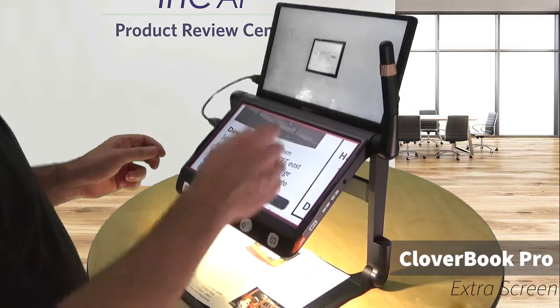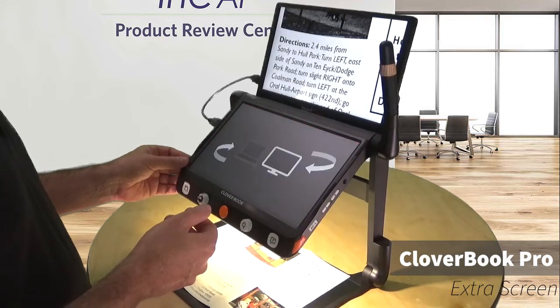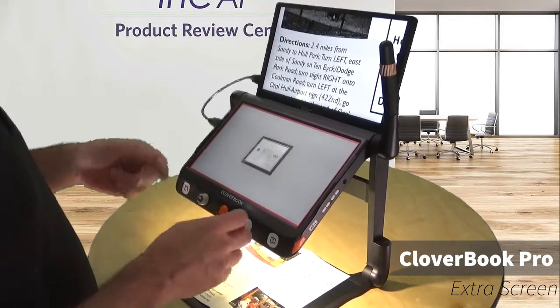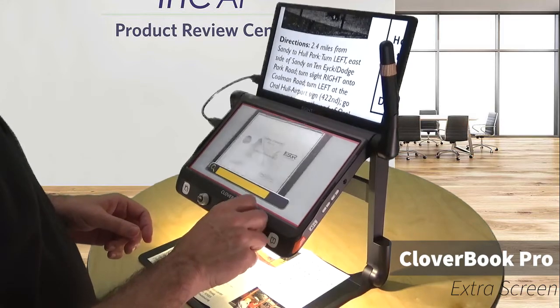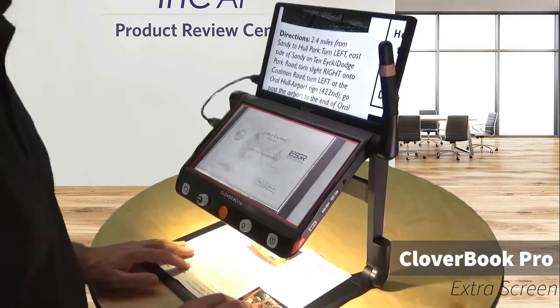And then I can still see in the distance. Now if I want to control that camera, I just hit it again. Now I've got my close view up here and my distance here. I can zoom in, check out what the presenter's doing. Still have a desk view up here for taking notes or whatever.